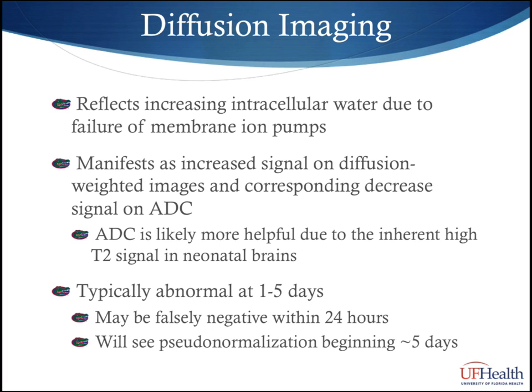Diffusion imaging plays a major role in the diagnosis of HIE. Essentially, what we are measuring is the ease at which water molecules diffuse in space. The more restricted the diffusion of water implies that there are barriers to normal Brownian motion of water.